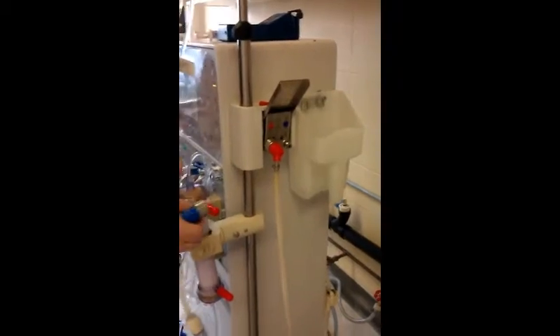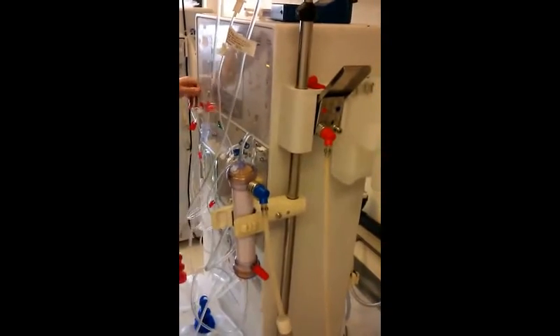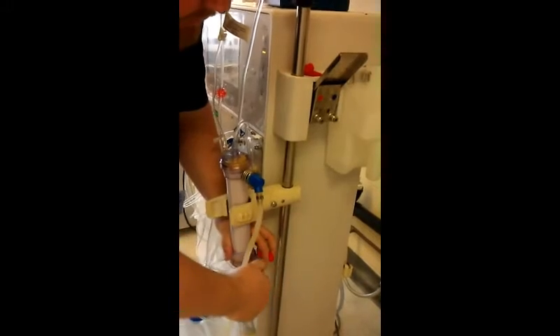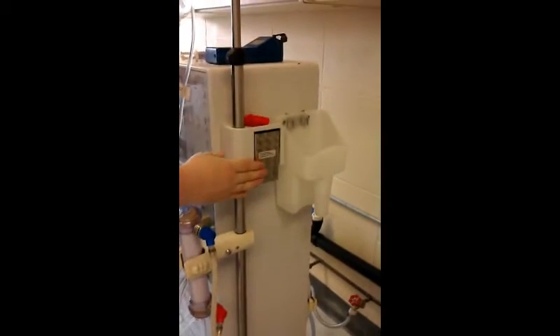Since I have this on my hand, I'm going to connect it to the dialyzer now. I take off the cap and connect it to the dialyzer. I'm going to go ahead and take the red one off, do the same thing, and connect it to the dialyzer. There's a little well up here that holds all your little caps. Close my door.